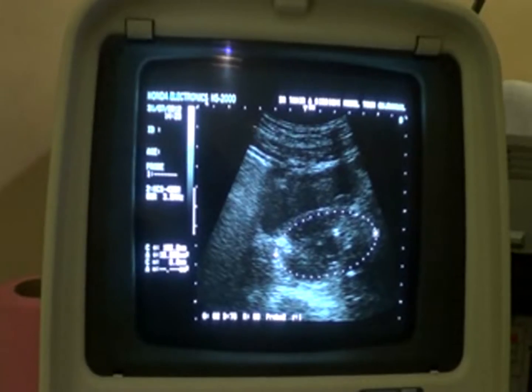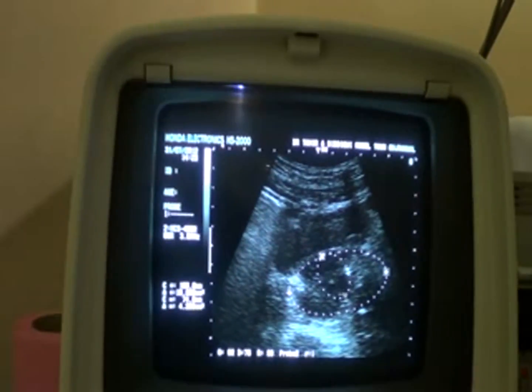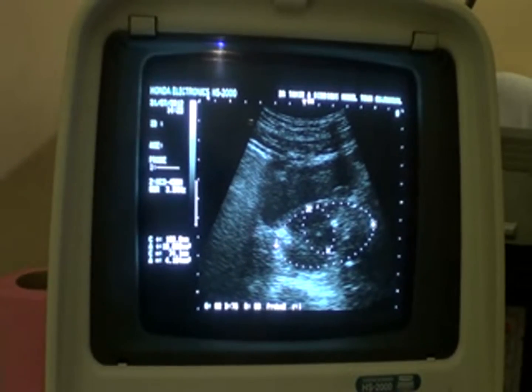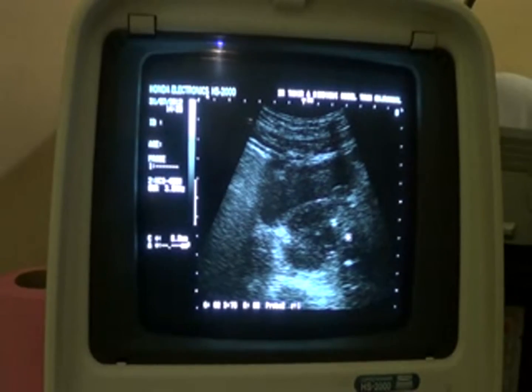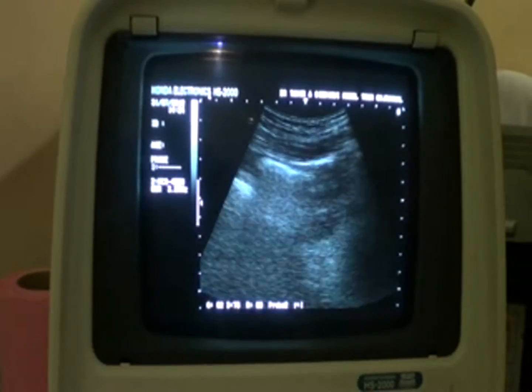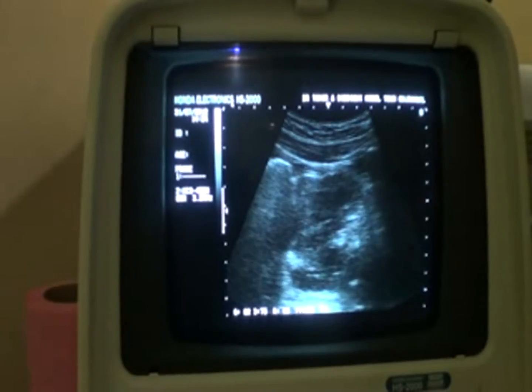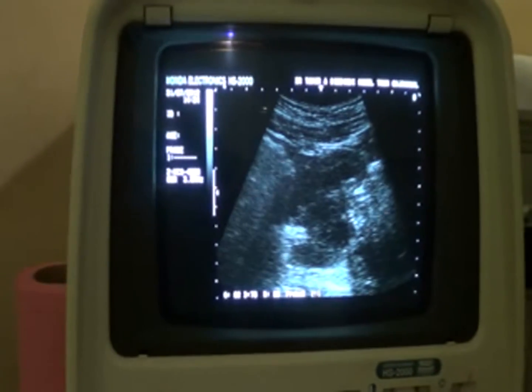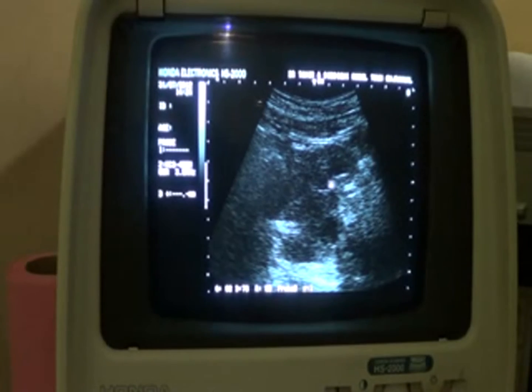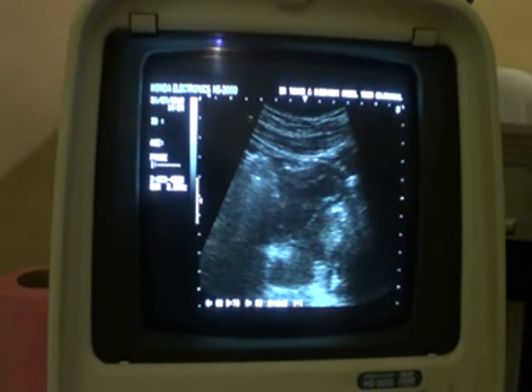These are the focal lesions in it. One is this, with marginal calcification, and this is the second one, posterior to it. And one thing to note is that the prostatic urethra is spared by these focal lesions. That will be more clear in longitudinal section. You see this. This is the urinary bladder, and here is the prostatic urethra. There is no calculus in it. It's clear.